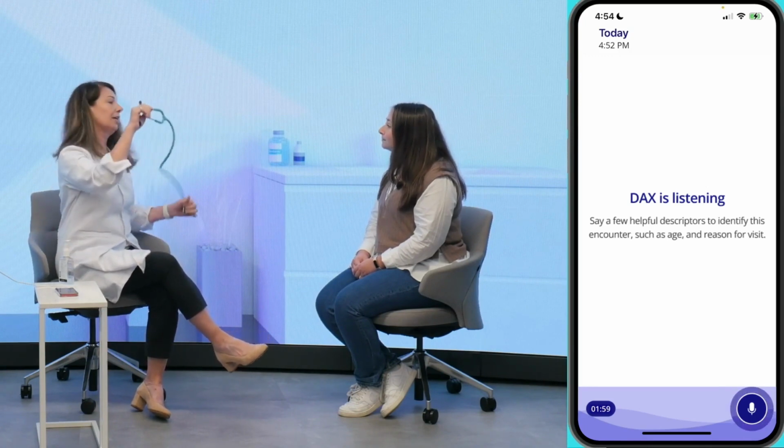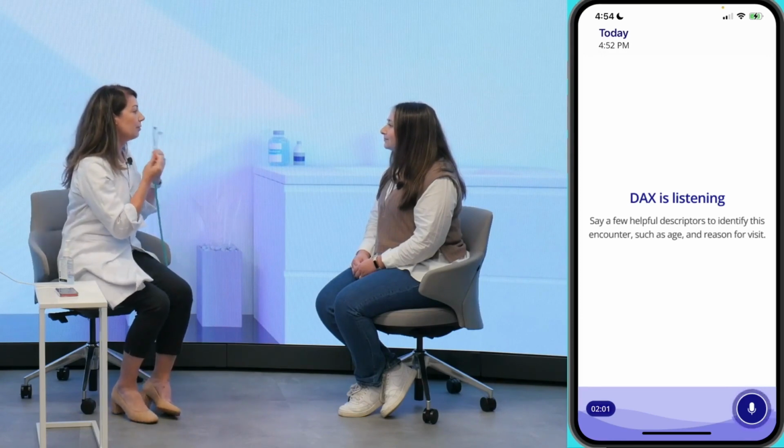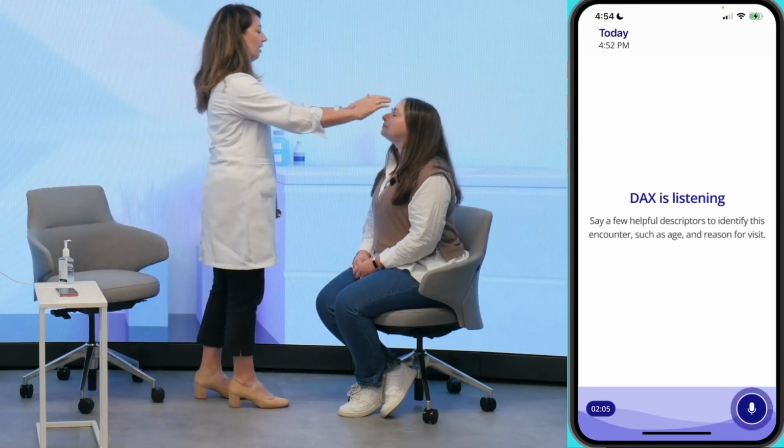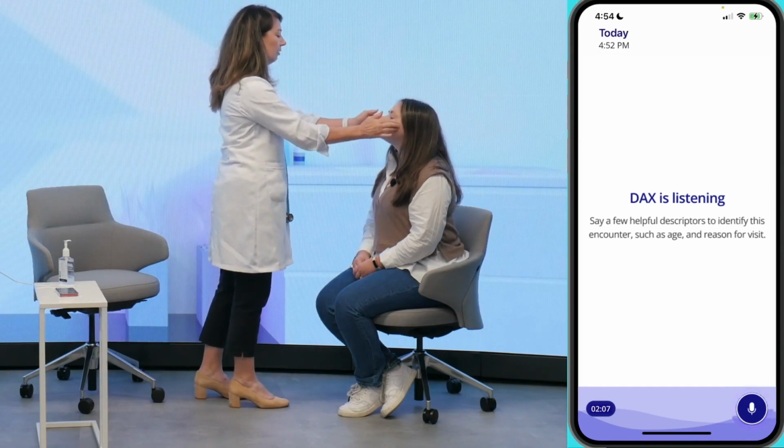Okay. I don't want you to worry. I'm going to be calling out some of these exam findings, but I'm going to let you know what that means when I'm done, okay? Okay. All right. I'm going to go ahead and just start by pressing on your face here. Any pain when I press on your face? Just on my forehead a little bit.